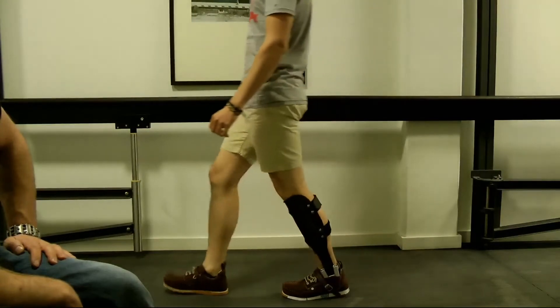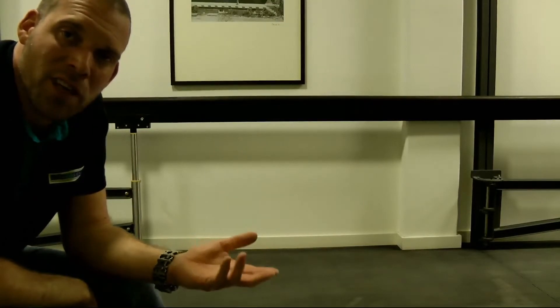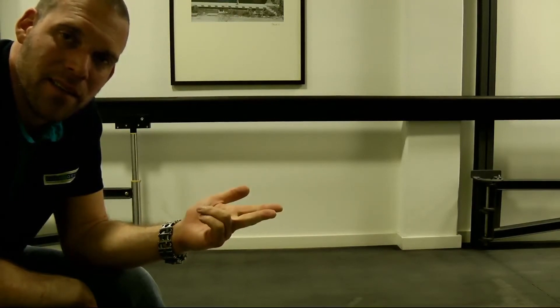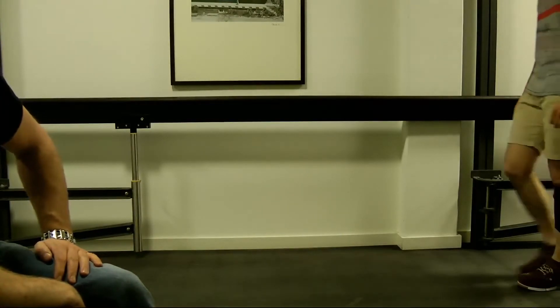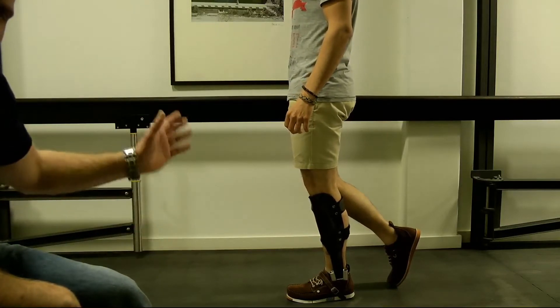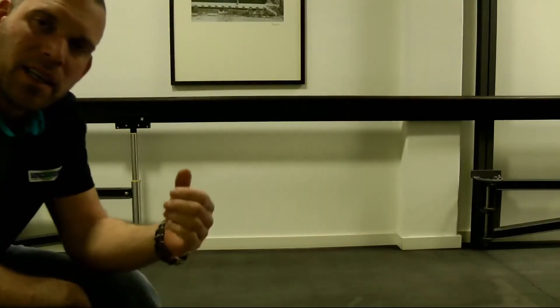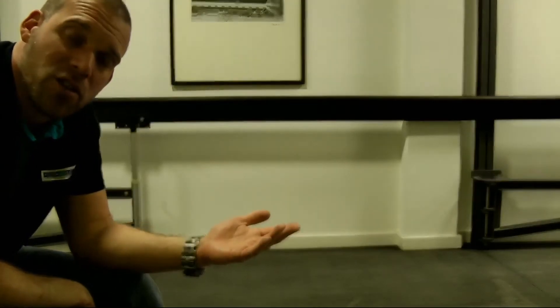Here we are at the next gait phase: initial contact, loading response, and now mid-stance. We will look at what happens in the mid-stance phase, although we already looked at this in the static alignment. This is the position we were looking for statically, and we also check the knee angle in the mid-stance phase again during the dynamic alignment. The knee angle in the mid-stance phase should be the same as the knee angle selected previously in the static alignment.